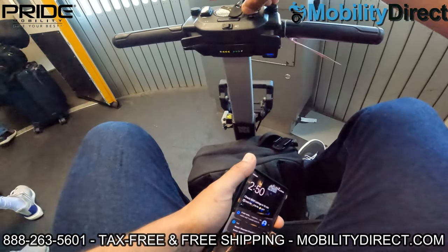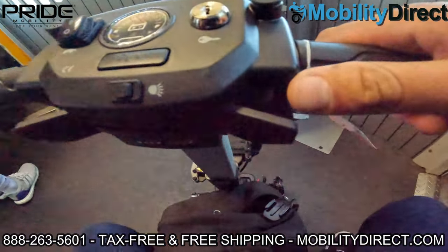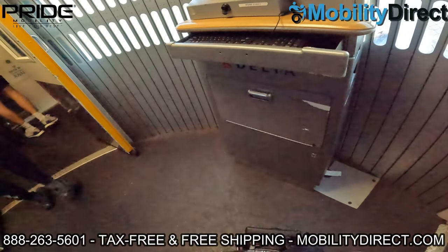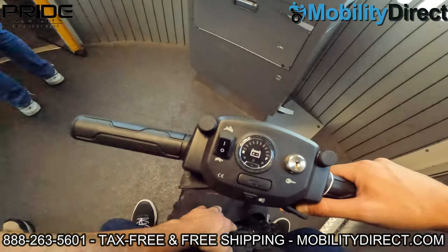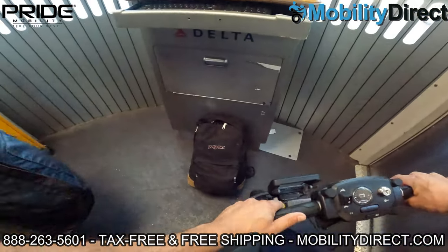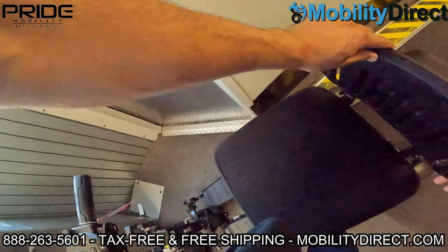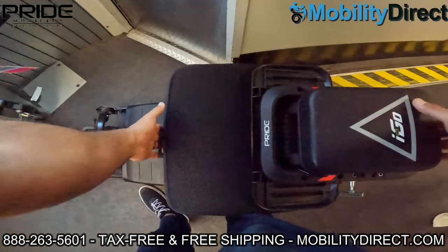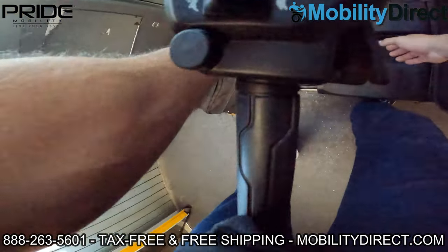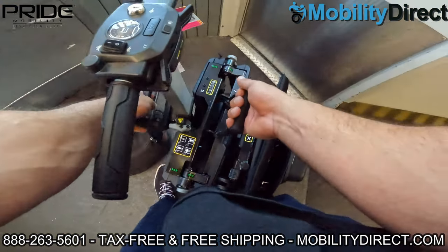I would recommend turning the automatic brakes off so that the handlers don't have a hard time moving the unit. If your brakes are on, the wheels won't turn and the airline attendants responsible for moving the powered mobility device into storage might not know how to turn those brakes off. These airline attendants are not well versed on these products, so something as simple as turning off the automatic braking system can prevent them from dragging the scooter and burning out the rubber on the tires. So I'm folding it up here — it's a pretty simple process with a little lock on the left-hand side.